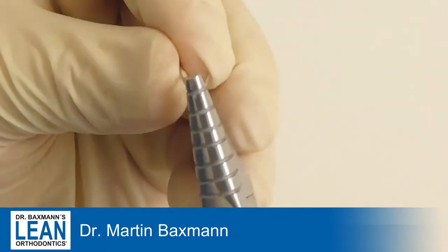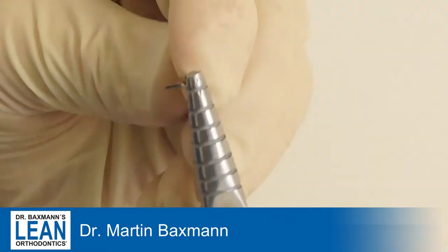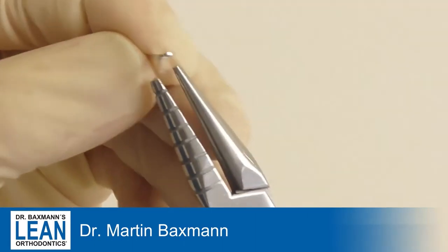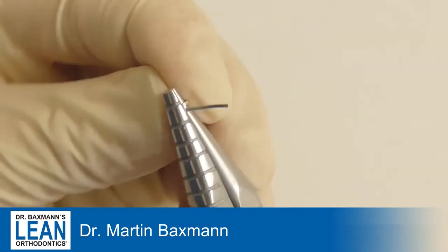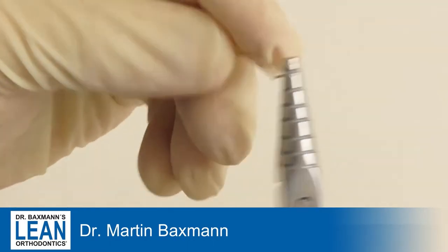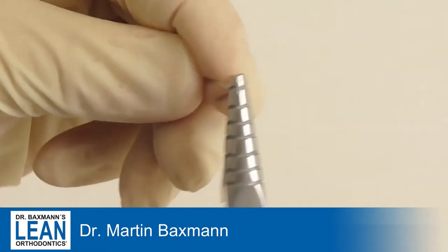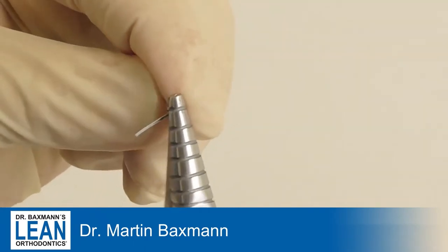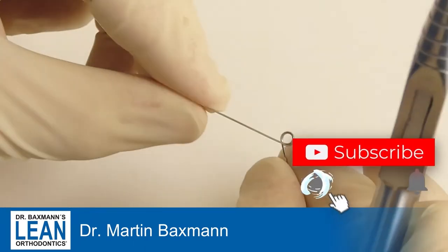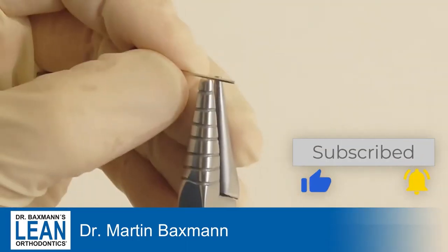The cantilever will be bent with a 17-25 stainless steel wire and a loop bending plier, as you can see here, and we start with a double helix. We leave a little end which will go into the molar tube, and a much longer arm which will reach out to the canine.